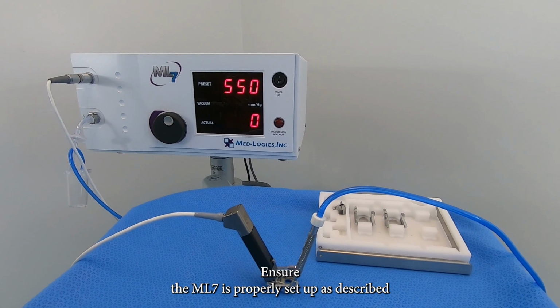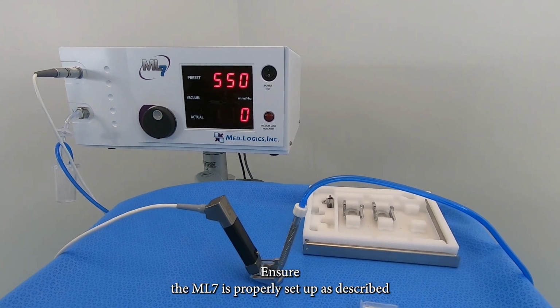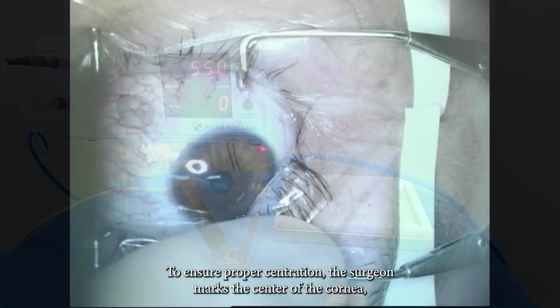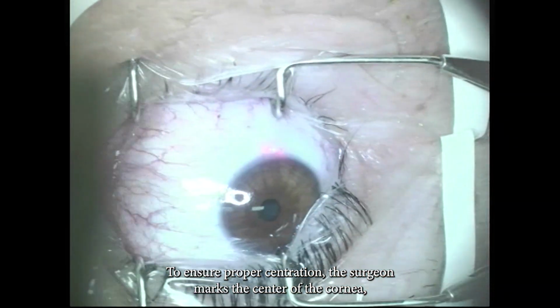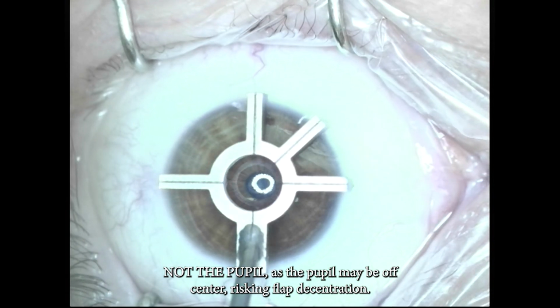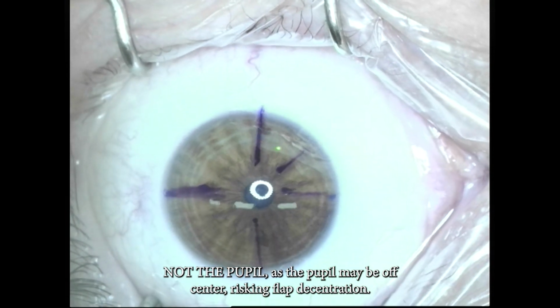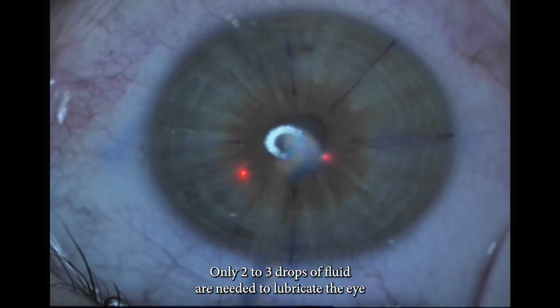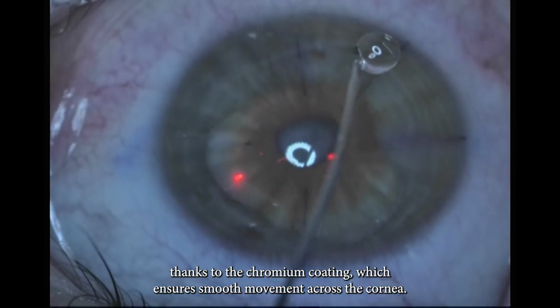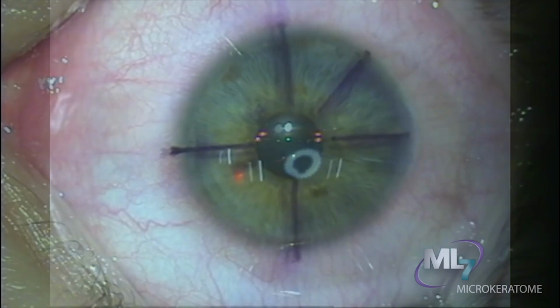Ensure the ML7 is properly set up as described in the ML7 surgical setup training video. To ensure proper centration, the surgeon marks the center of the cornea, not the pupil, as the pupil may be off-center, risking flap decentration. Only 2 to 3 drops of fluid are needed to lubricate the eye thanks to the chromium coating, which ensures smooth movement across the cornea.